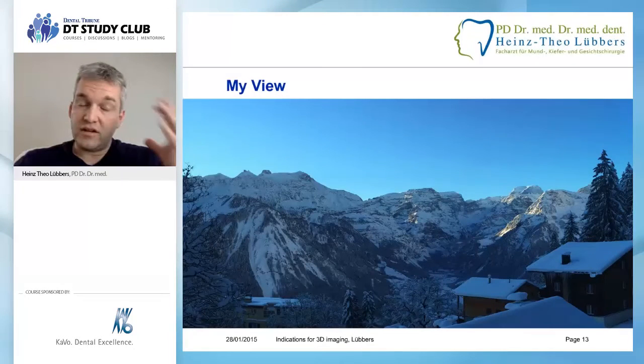So what I can present today is kind of my view. I can, of course, give you an overview of what the consensus statements of the different countries say, but basically it's after all a subjective view of myself on which indications for cone beam CT are useful and which are not.